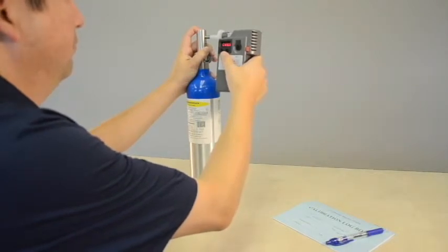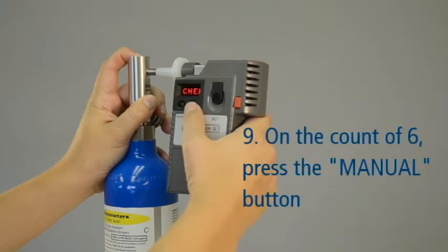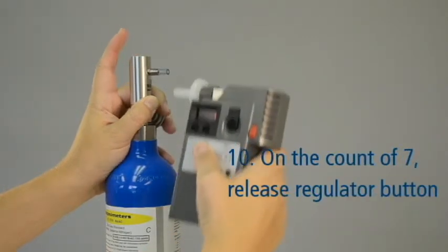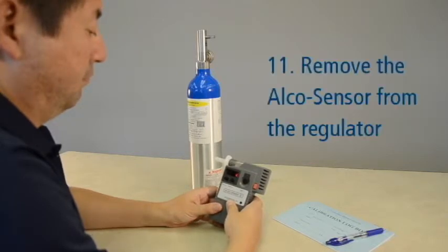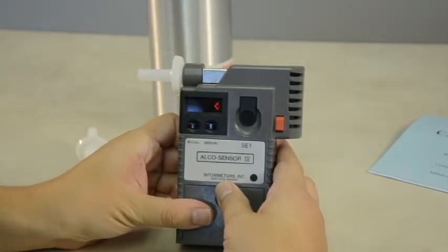To take a gas sample, press and hold the regulator button and count to 7. When you reach the count of 6, press the MANUAL button on the front of the device. On the count of 7, release the regulator button. Gas must be flowing through the mouthpiece when the MANUAL button is pressed. Remove the Alkosensor 4 with Memory and mouthpiece from the regulator. Once the sample has been taken, the device will flash the back and forth arrow signs for several seconds as it analyzes the sample, and then will display the result as a three-digit number.